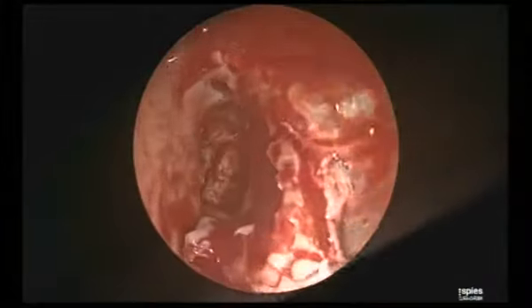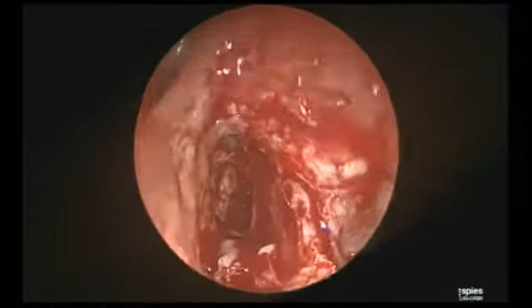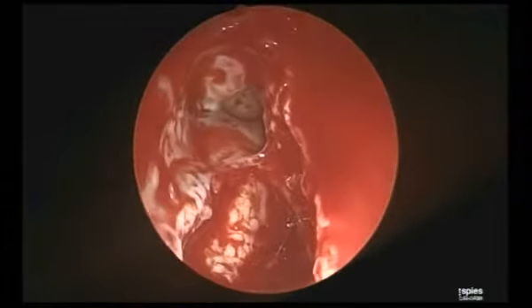Can we see it being used at some point of time? Yes, just now. I am showing you. Now you can sometimes see multiple openings in this region. Can you see that?